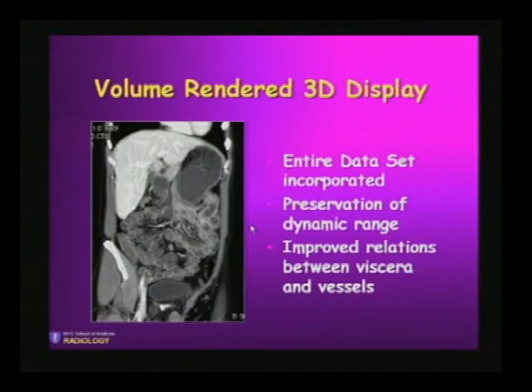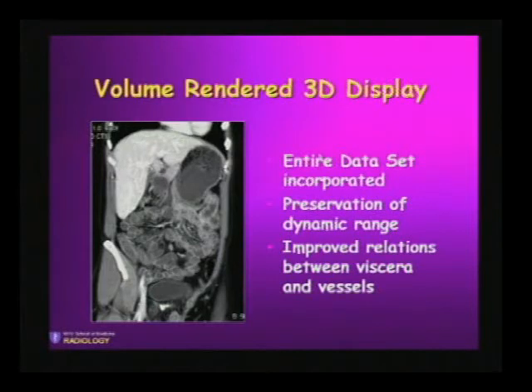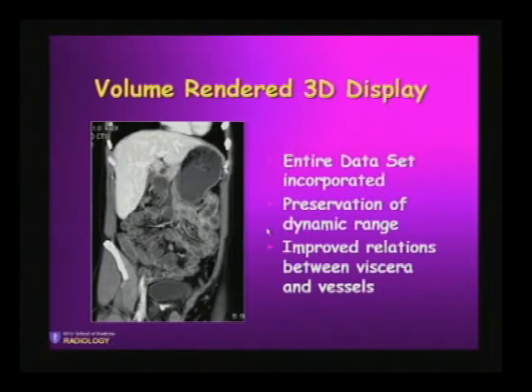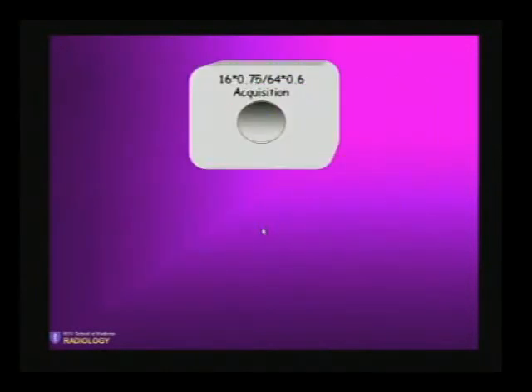Really, the major advantage now that technology and computer software has given us — available with most vendors — is the ability to create volume-rendered 3D images. Here we incorporate the entire data set. We preserve the dynamic range of contrast so the image looks very similar to a CT image, rendered by brightness and opacity of tissues. You get improved relationships between the viscera and the vessels, and the opportunity to interact with this on a 3D workstation.